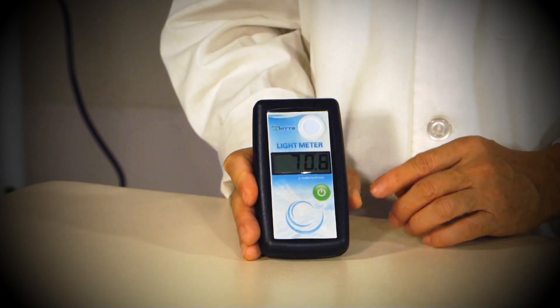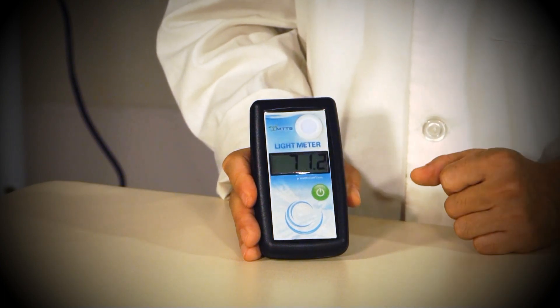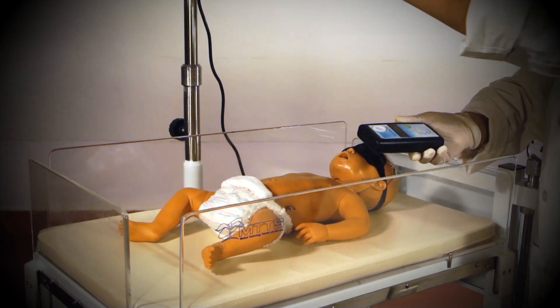The light intensity will be shown as a number in the digital display of the light meter. When measuring the intensity of a phototherapy machine, remember not to cover the filter with your fingers as this will cause the reading to be inaccurate.